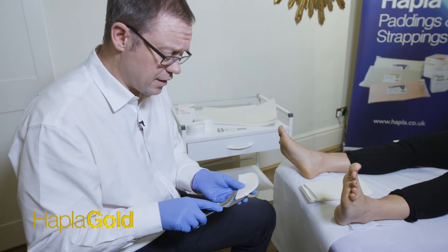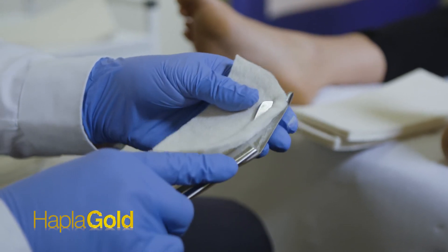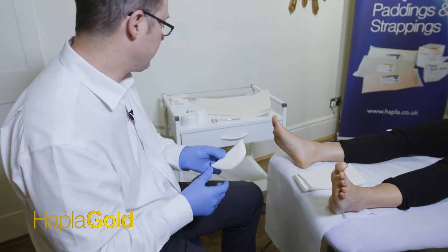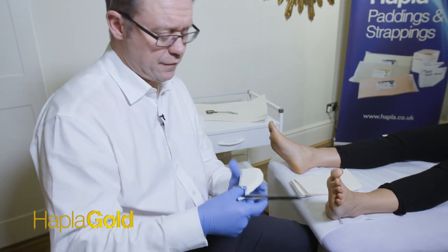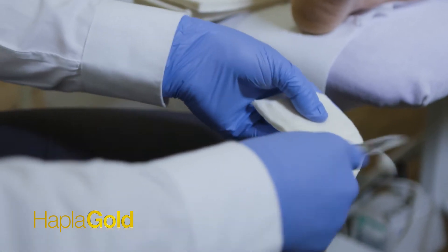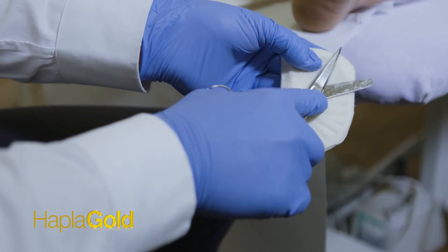Now we cut a 45 degree bevel around the edge of the valgus filler. This makes it sit flush with the skin. Once we've cut the 45 degree beveling, we'll add to this a pie crust bevel, which will further make it sit nice and flush with the skin. When pie crusting, we push up the felt underneath the felt we're going to cut, and that gives a nice long bevel.